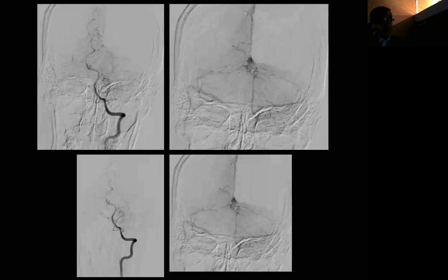This is the venous outflow pattern that we see with the vertebral or posterior circulation supply. It did not show anything in particular. Sometimes you see prominent veins, as you see here, because there is a higher flow into the inferior sagittal sinus due to the compression or the high pressure. Many people now relate seizure to the increase in cortical venous pressure due to the meningiomas. This is why sometimes you see prominent posterior venous drainage, like in this case, but there is no particular supply from dural branches.